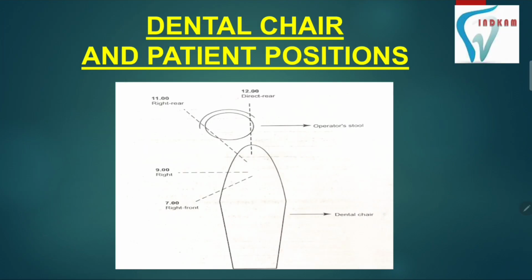Hello friends, today we are going to learn about dental chair and patient positions.